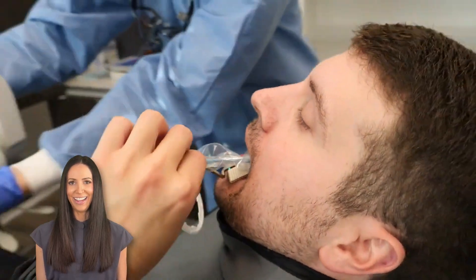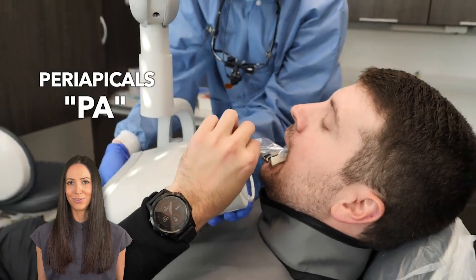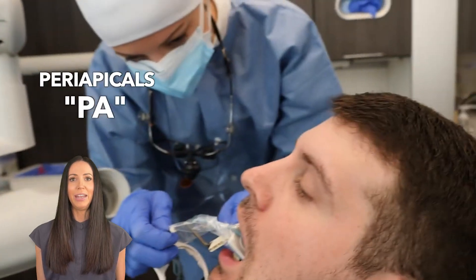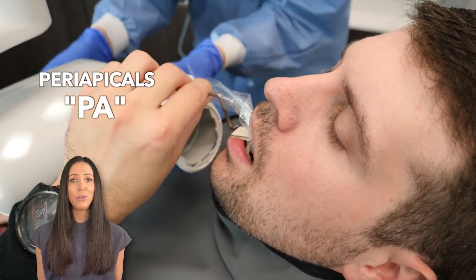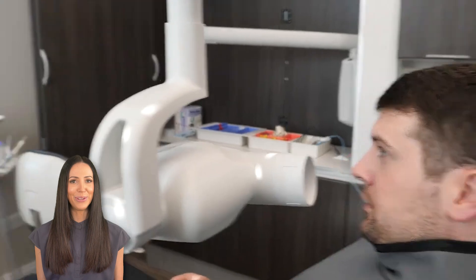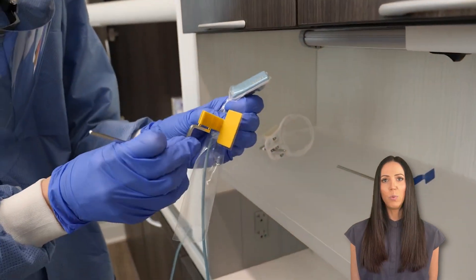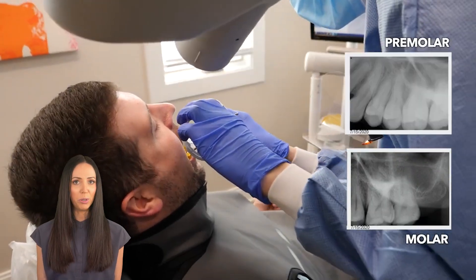Now we are taking PAs, which are also known as periapicals. They allow us to see the entire root and the area all around it, like to check for an abscess and the health of the tooth in general. Now that we're finishing up with the front teeth — the anterior teeth — we've moved on to the back teeth, also known as the posterior teeth, where we take two in each quadrant: one for the molars and one for the premolars.